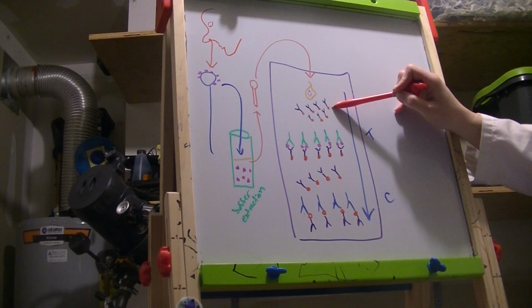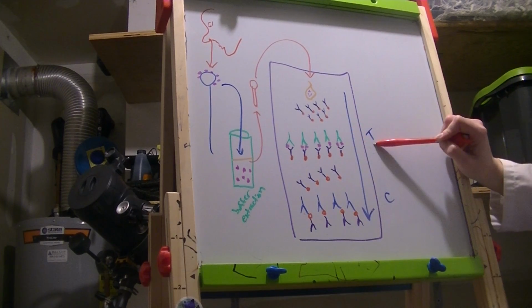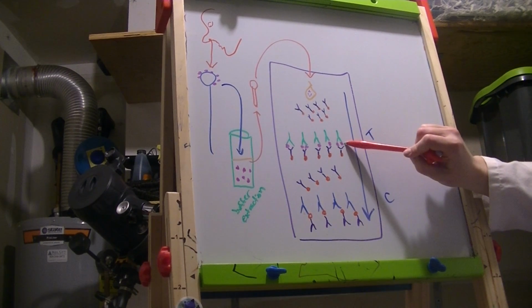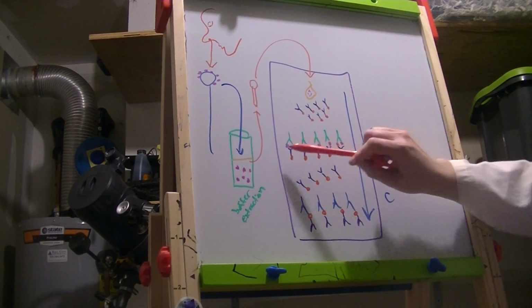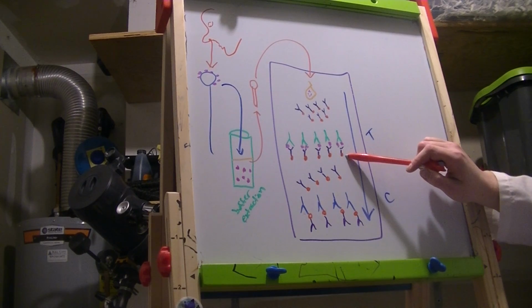After those antibodies bind to the antigens from flu A or flu B, and they travel downward to the test area, there are immobilized or fixed antibodies in the test area that also will bind to the flu antigen, which will make all of the antibodies with the colored particles stop in this area, and that's why we see a colored line. All those colored particles have gotten together there.